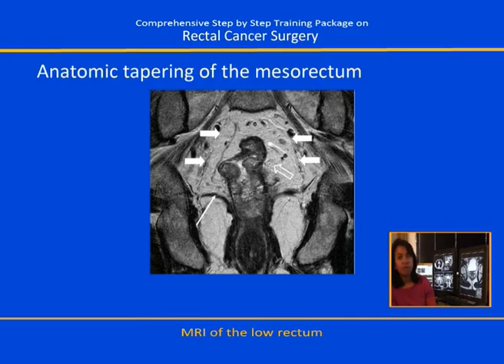They may stop more laterally and therefore enable the so-called extralevator operation, which takes the surgeon outside this plane and avoids the possibility of entering this dangerous corner by staying outside the levator and then meeting the TME dissection much more laterally than has previously occurred.